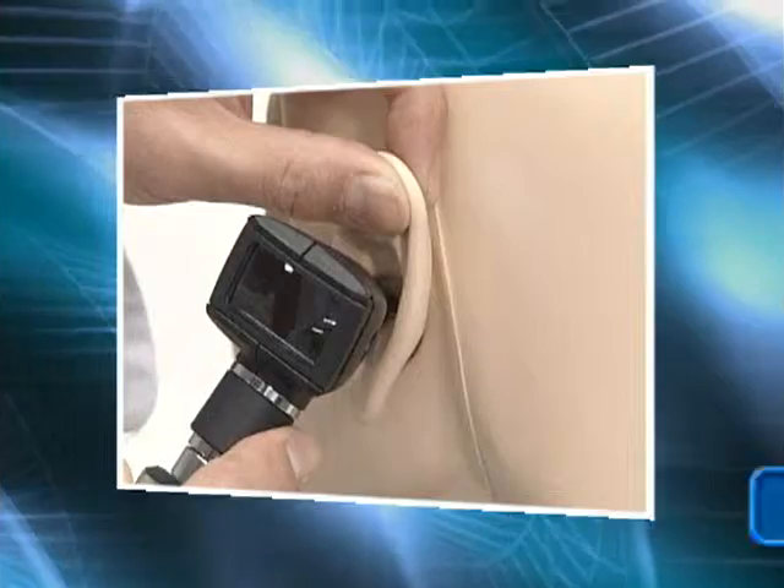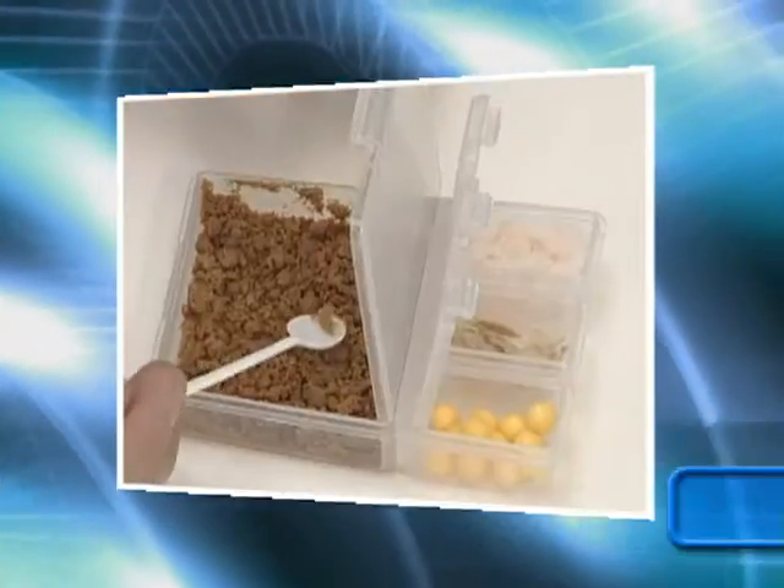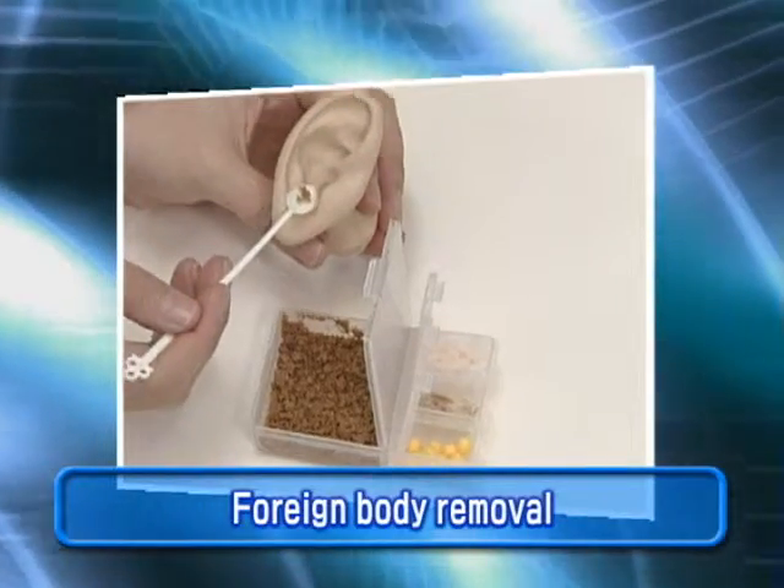The Ear Examination Simulator is a training model for otoscopy skills, including differentiation of common pathologies and other important cases.